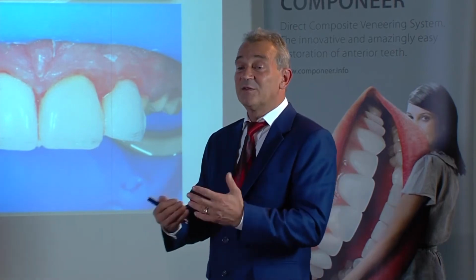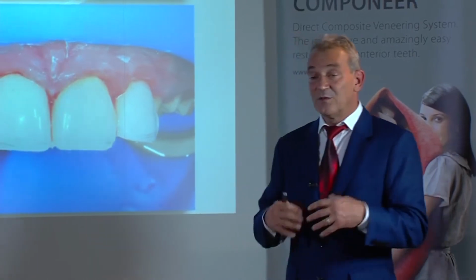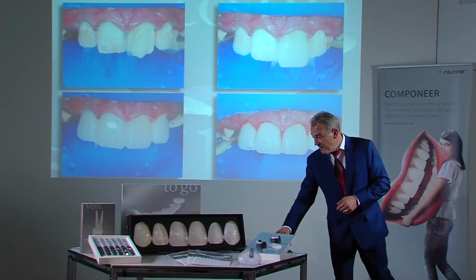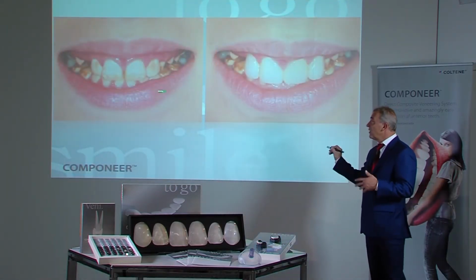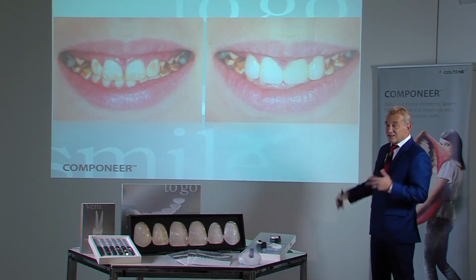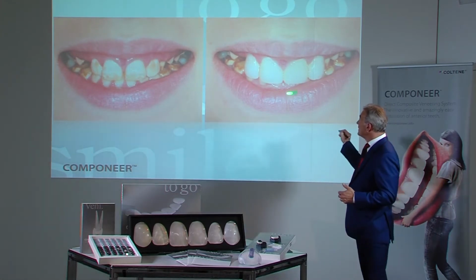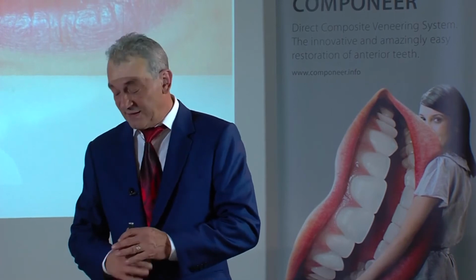We only have a limited time window to create the surface, with the direct technique, and shaping of the teeth must be performed relatively quickly. They are certainly too long and too large, but of course we can adjust that at the end. The problem in the posterior area will continue to exist, that is for sure. But the child will no longer be inhibited so much at school than before.